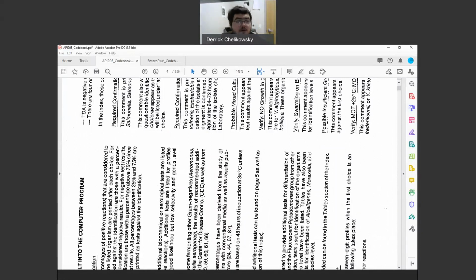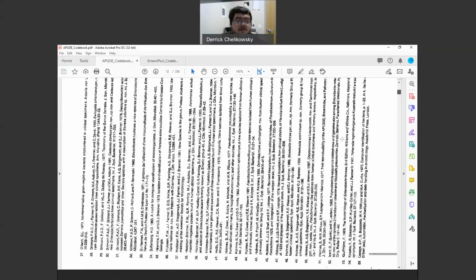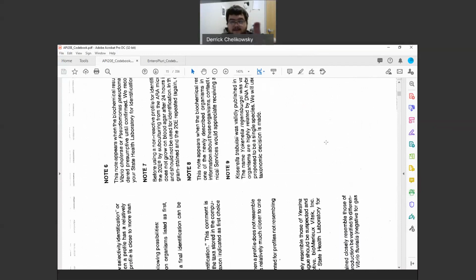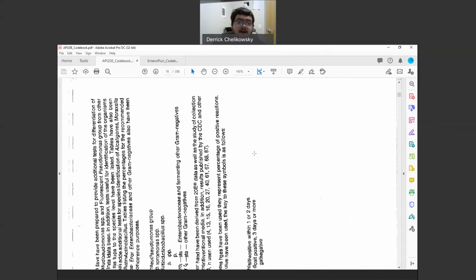Now, once again, we have a specific code. And our code this time is 0044040. So let's take a look at what that will be. Now, unlike the other book, you will possibly have to flip this or flip your tablet or whatever you're reading it on, since it is simply a scan.